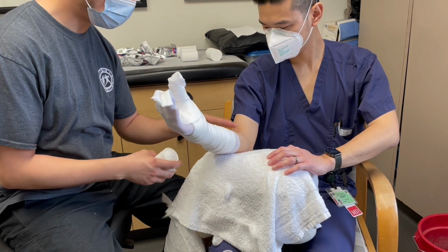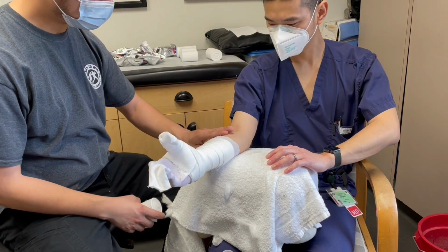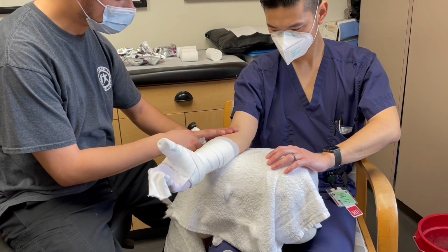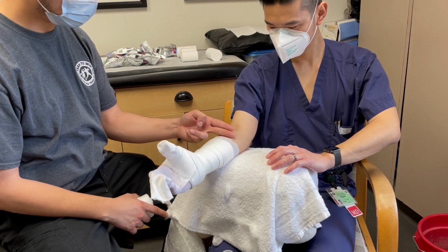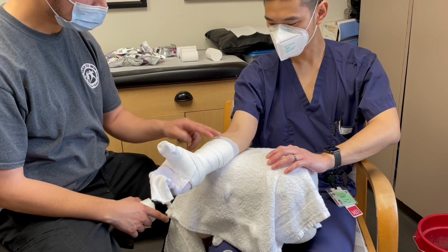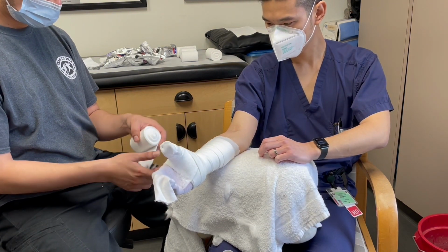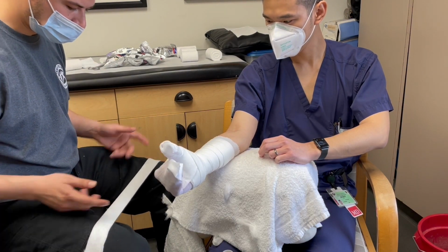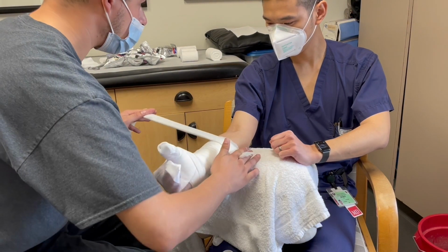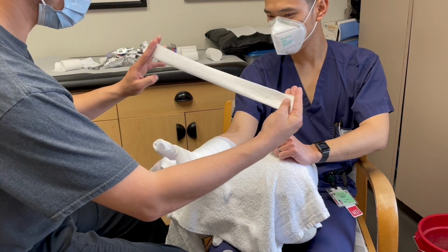Remember with a short arm and thumb spica cast, the cast should extend up to the forearm's proximal third, approximately 2 to 3 finger breadths below the antecubital space. At both ends of the short arm cast, we would take the 3-inch padding and fold it in half, and then pad the end right here.